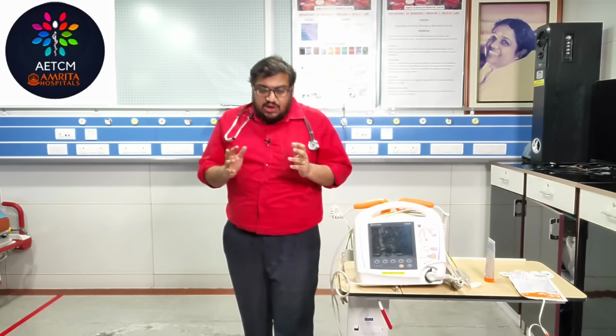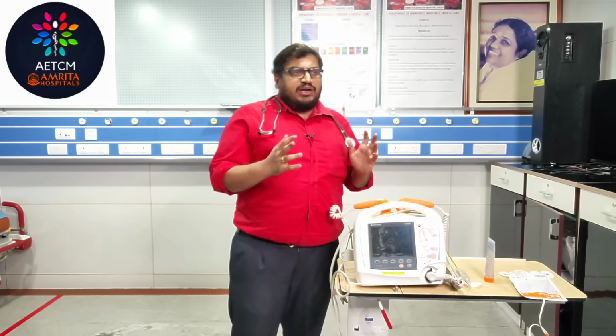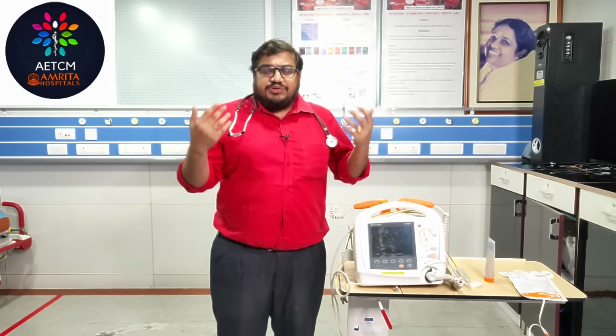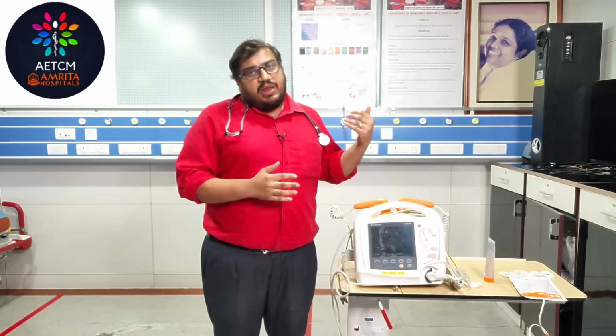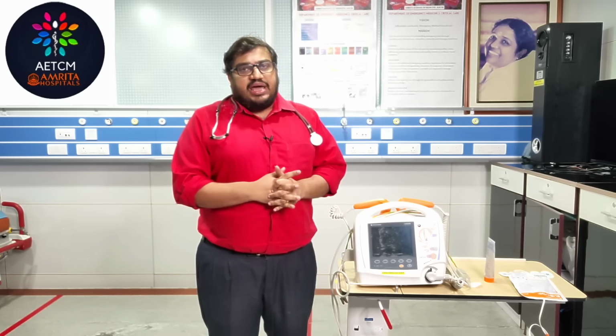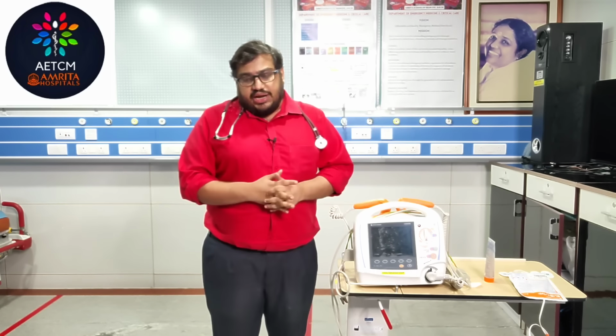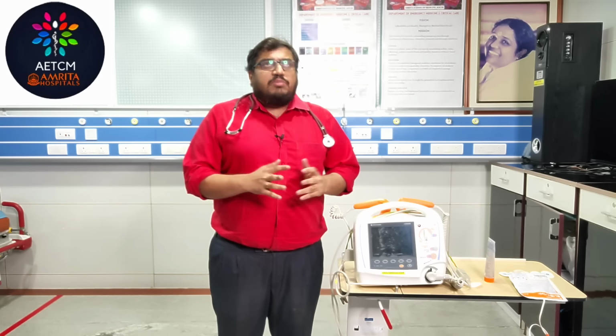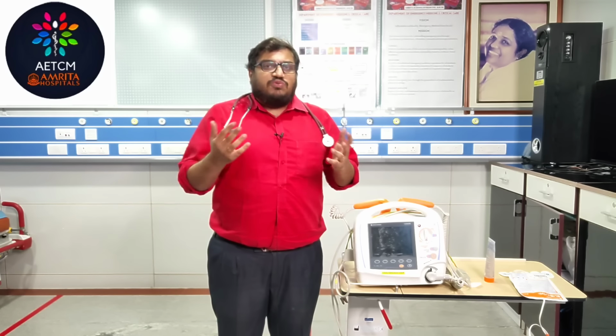So first of all, let's see what is basically a defibrillator. The defibrillator was invented somewhere in the 1950s. At that time, they tried to revert ventricular fibrillation and found it successful, and from 1960 onwards they identified that it could be used for direct cardioversion. So that is the history of the defibrillator. Basically defibrillators are divided into two or three types. You can have a biphasic defibrillator and a monophasic defibrillator.